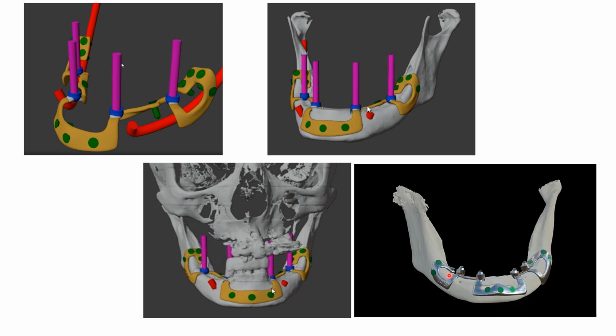So here we have a subperiosteal implant for the mandibular full arch prosthesis with four multi-unit titanium abutments attached to it in the design itself. And over this, once these implants are placed using titanium screws provided by the manufacturer, the overdenture or the full arch all on four type of prosthesis.